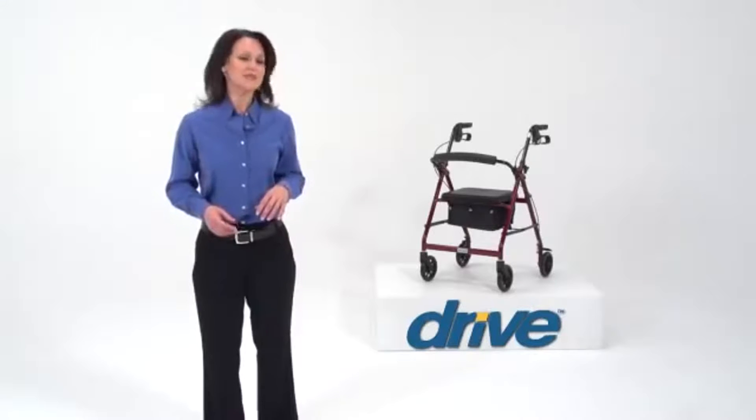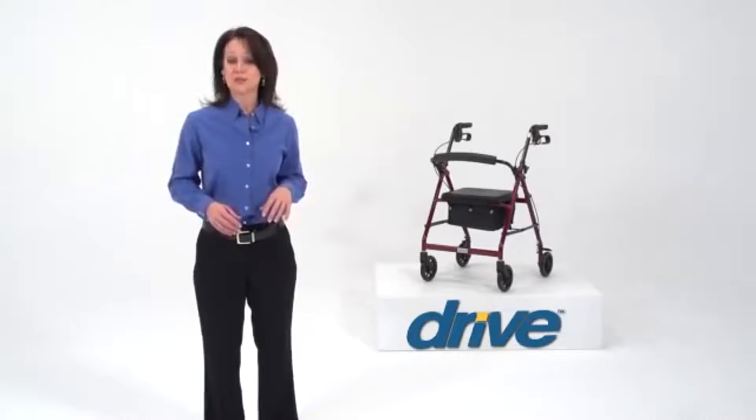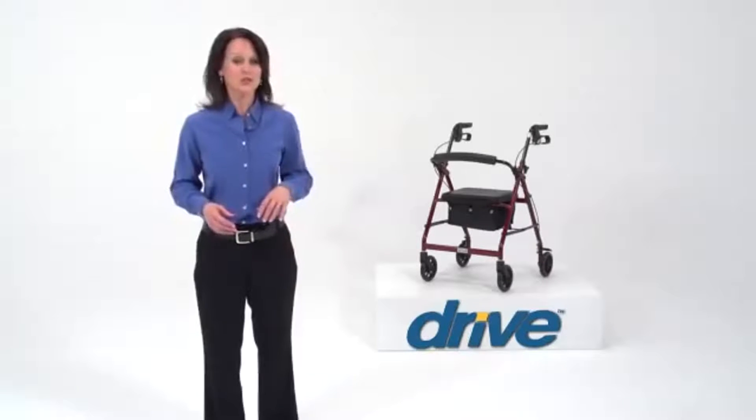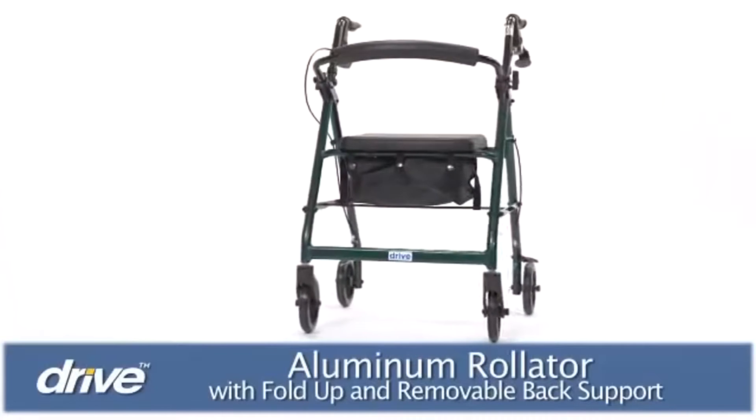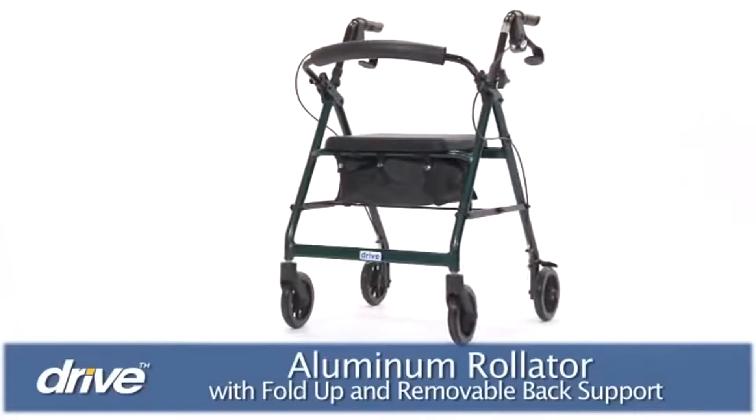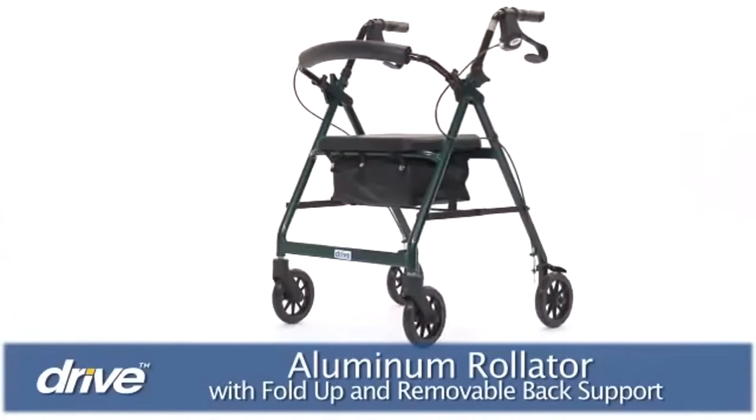Even active individuals sometimes can benefit from walking support and the ability to take short rests when they're on the go. Drive Medical's folding rollator offers the perfect solution to ensure stable, independent mobility every step of the way.